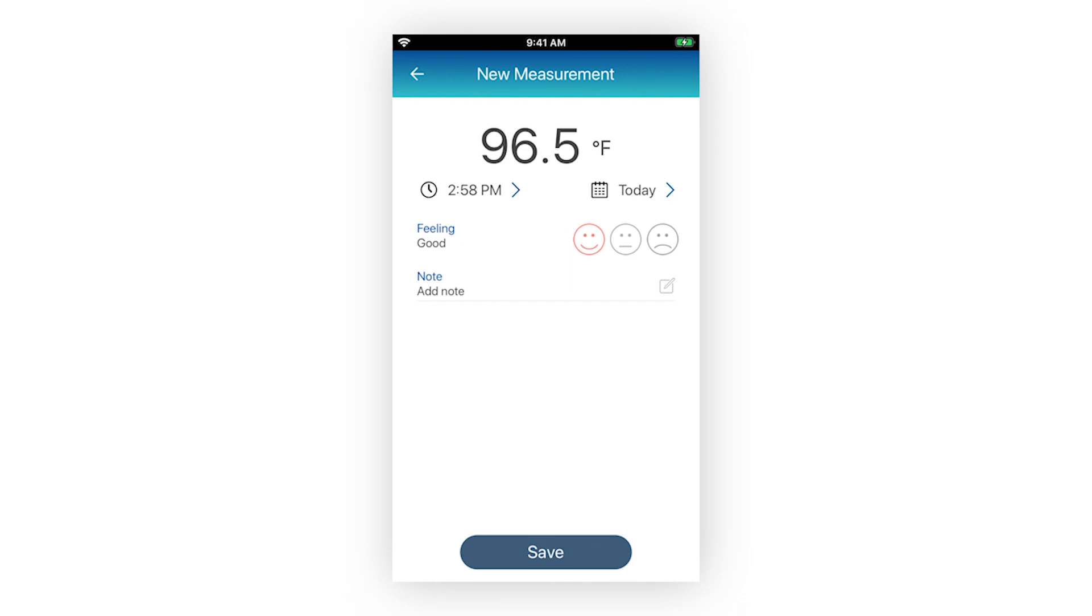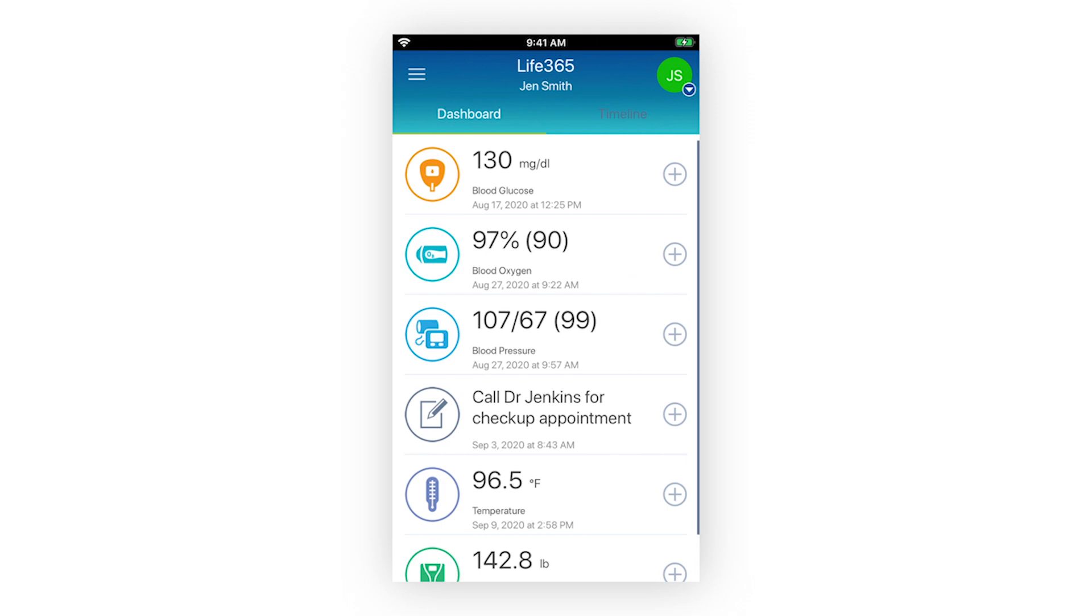For some measurement types, you can enter additional information, such as notes or how you were feeling when the measurement reading was taken. Once all information has been entered, select the button Save. Upon saving, you will be navigated to your dashboard screen.